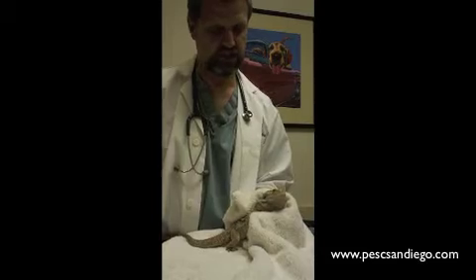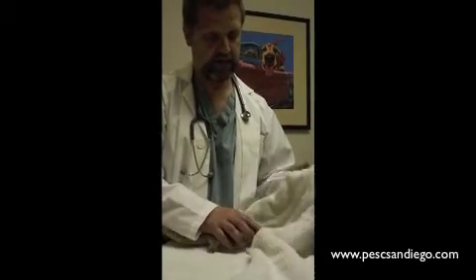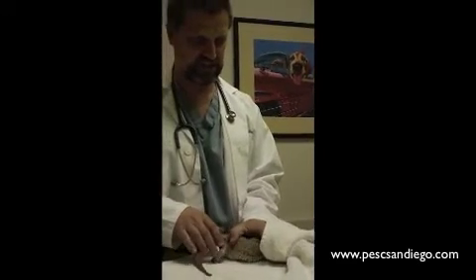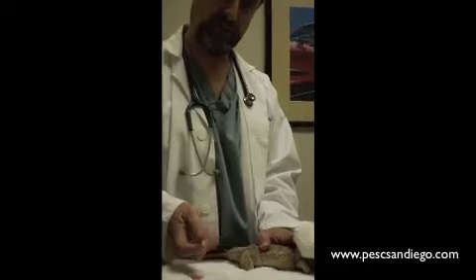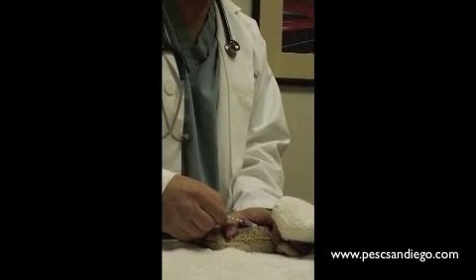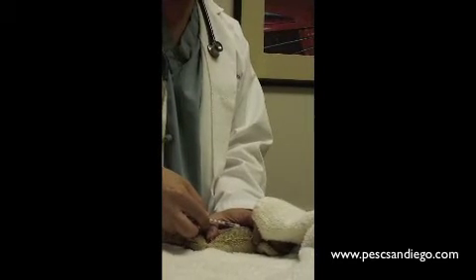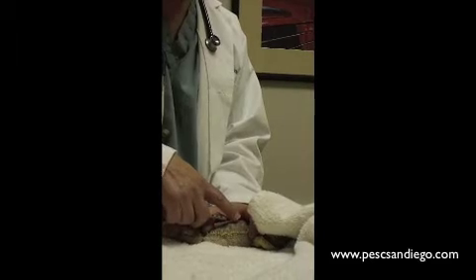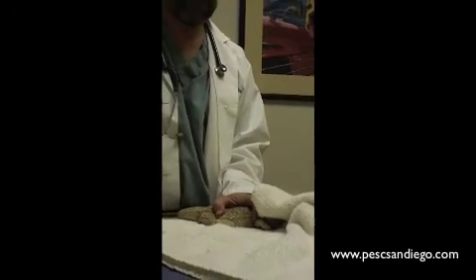For a subcutaneous injection, we're going to give it underneath the skin on the back. I like to kind of enclose them this way and cover their eyes so they're a little bit less nervous. We want to give all injections in the front half of the body. Sometimes two people help with restraint. We're going to slip this underneath the scale, keep it very flat. Once you feel it pop through the skin and give the injection, you'll often see the medicine gather underneath the skin in a little bleb. You'll pull straight out, and then we're done.